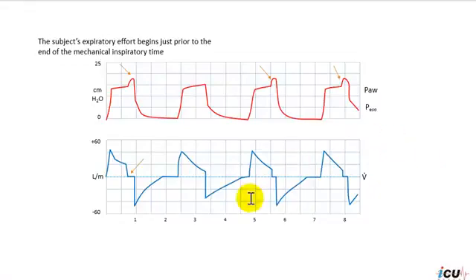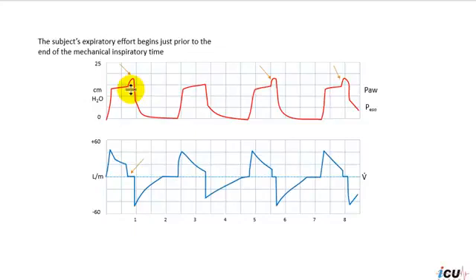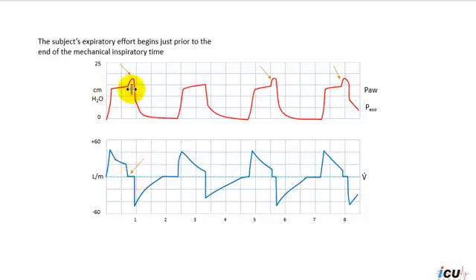Another example of early termination is on pressure regulated volume control mode of ventilation. Similar to the previous case, the subject's expiratory muscle efforts begin just prior to the end of the mechanical inspiratory time. That's why you see a rise in pressure at the end of inspiration. And because of the expiratory effort, the flow goes down to zero — you can appreciate zero flow in this breath, in this breath, and in this breath too.